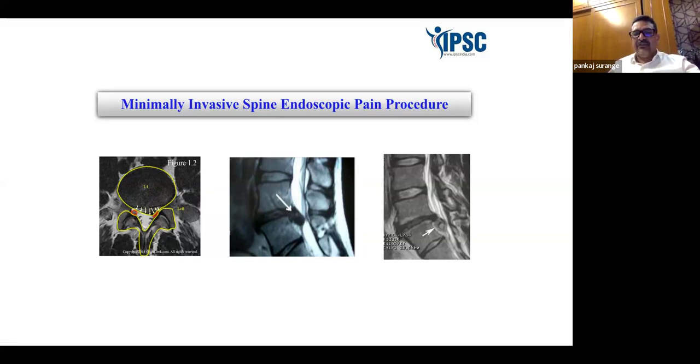If the herniation is big, compressing the nerve roots, and the patient has radiculopathy, there is no point in trying transforaminal neuroplasties. Unless there is some contraindication for endoscopic decompression, in which case we go further as a trial to give the patient some relief. But if we find such cases, it is better to go for the decompression, because we want to give a definitive treatment to the patient.